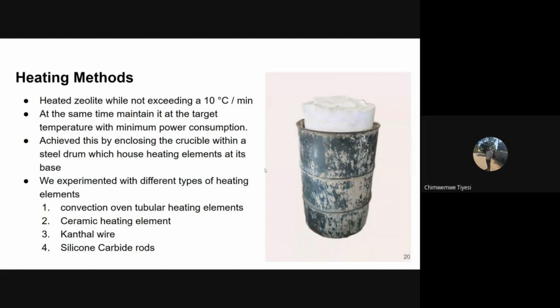To regenerate the zeolite, we needed to heat it as quickly as possible while not exceeding 10 degrees Celsius per minute in temperature, and to maintain this target temperature with minimal power consumption.